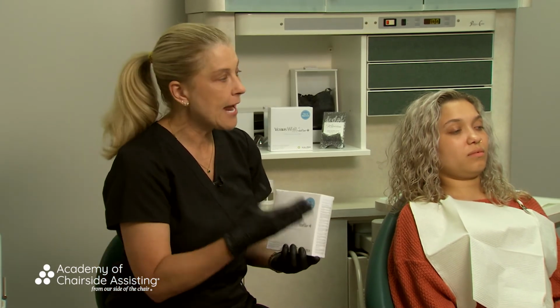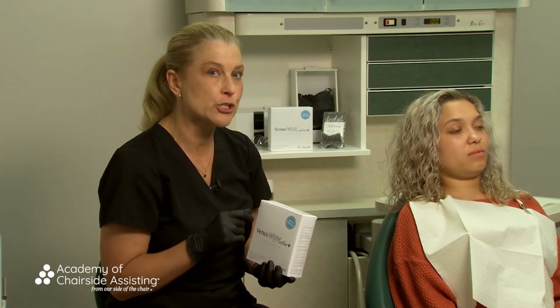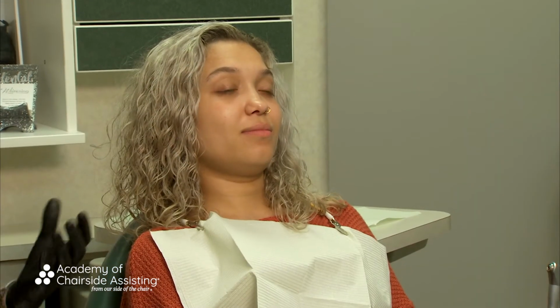And so now that it's been close to 20 minutes, we're going to remove the tray. I want to share with you exactly what I'm going to show patients and tell them what to do once they're finished with each whitening procedure at home, to make sure that we get all of the whitening agent off of their teeth. And then this way, making sure they're going to be in compliance every day for 7 days, not skipping a day. Okay, so now we're going to remove the trays.